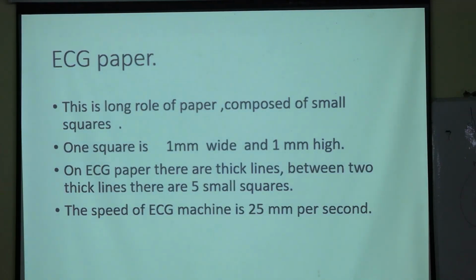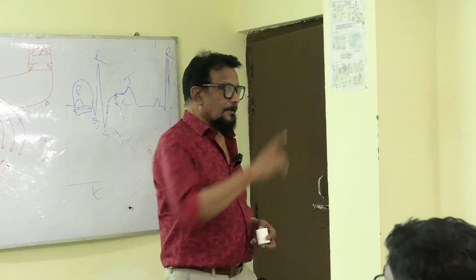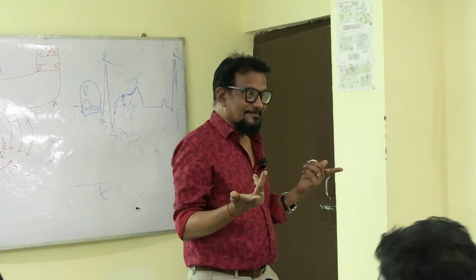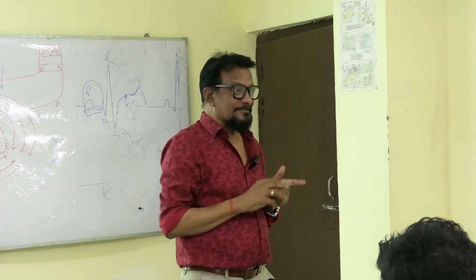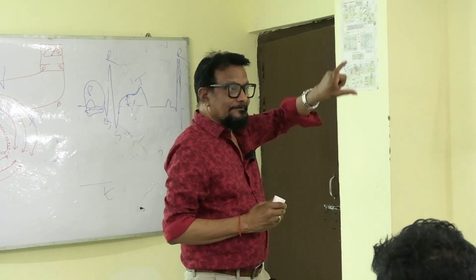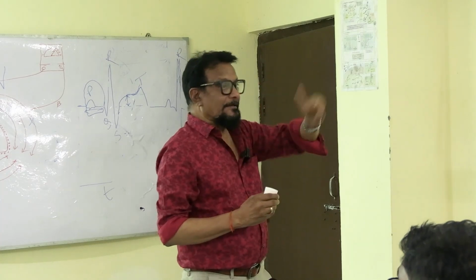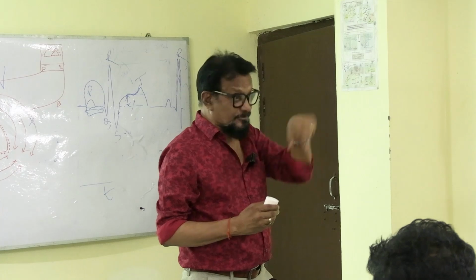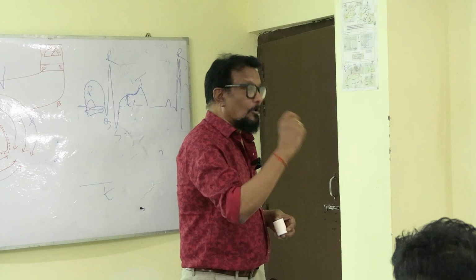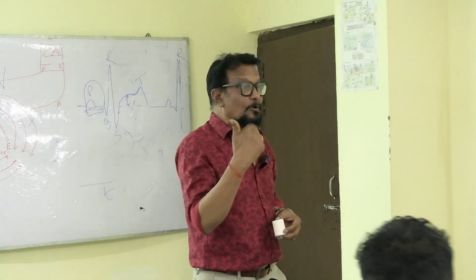Other day, did I show you the ECG paper, the different waves? These waves are electrical activity, potential change, the volt that you record in a galvanometer. In the galvanometer, the deflection is due to voltage change. So you have to recall the voltage of the P wave, the QRS wave and the T wave.